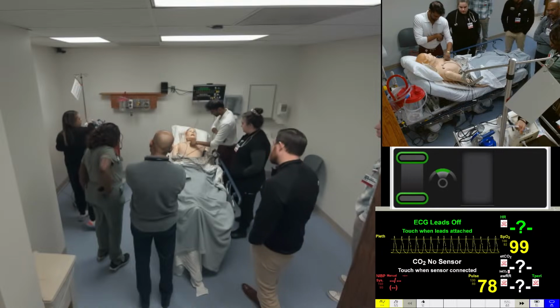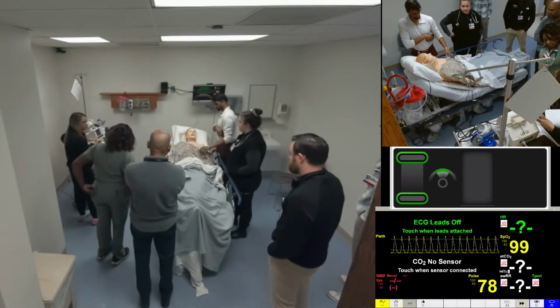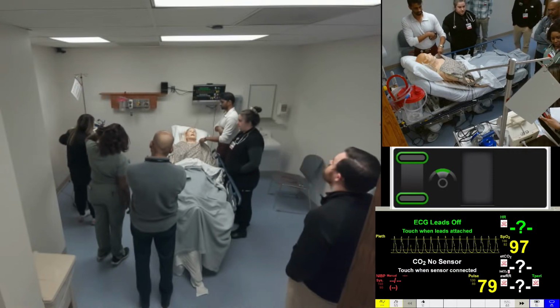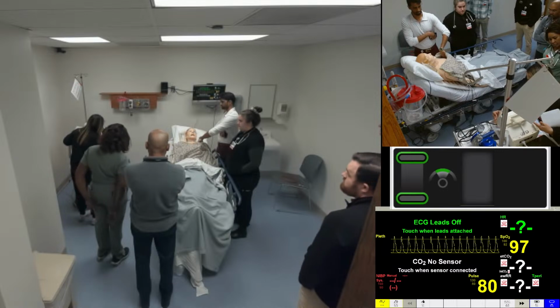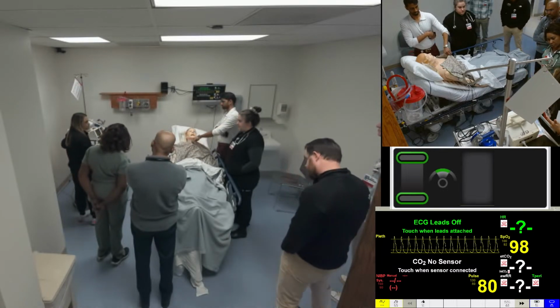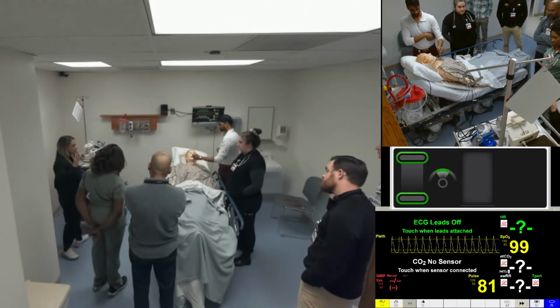Where? Yep, they're there. Remember to turn on your defibrillator. Sounds stupid, but people are forgetting to turn it on. And if you need more information, remember that you can pop that open so that you can manually change things for this person. Does that make sense? Okay, let's move outside.